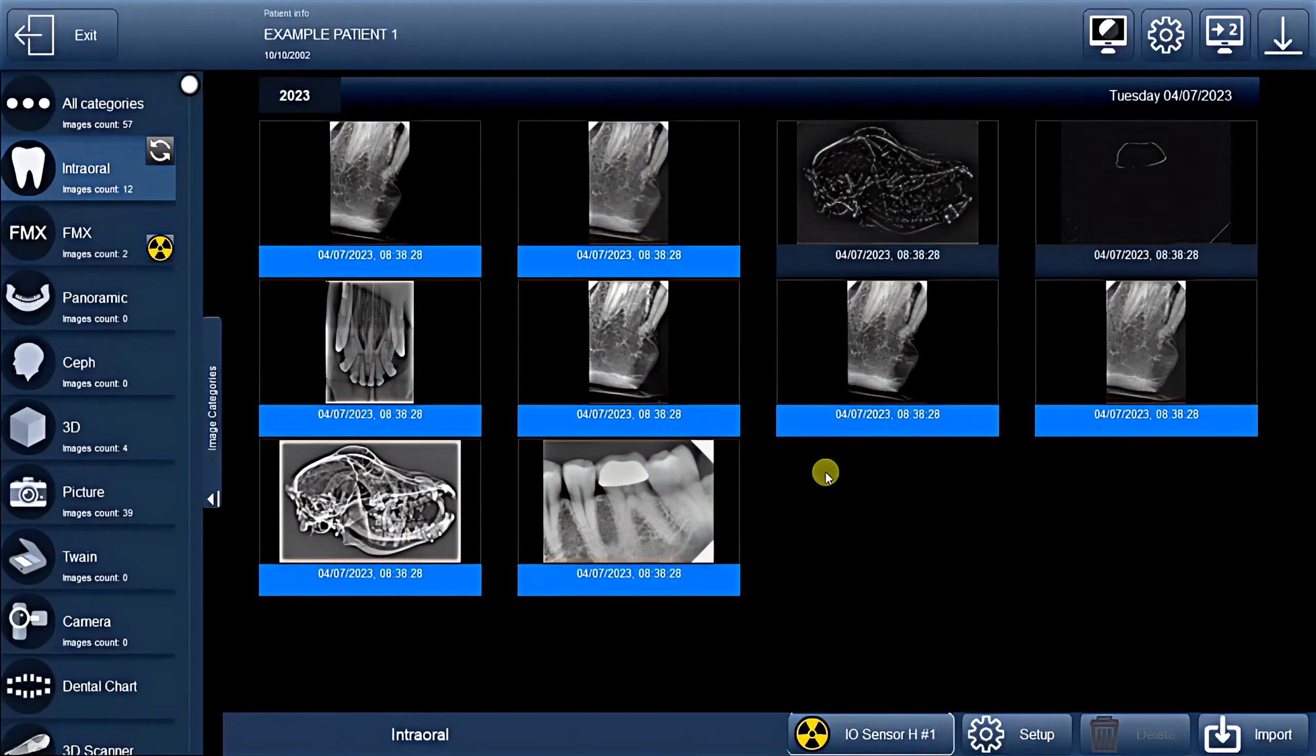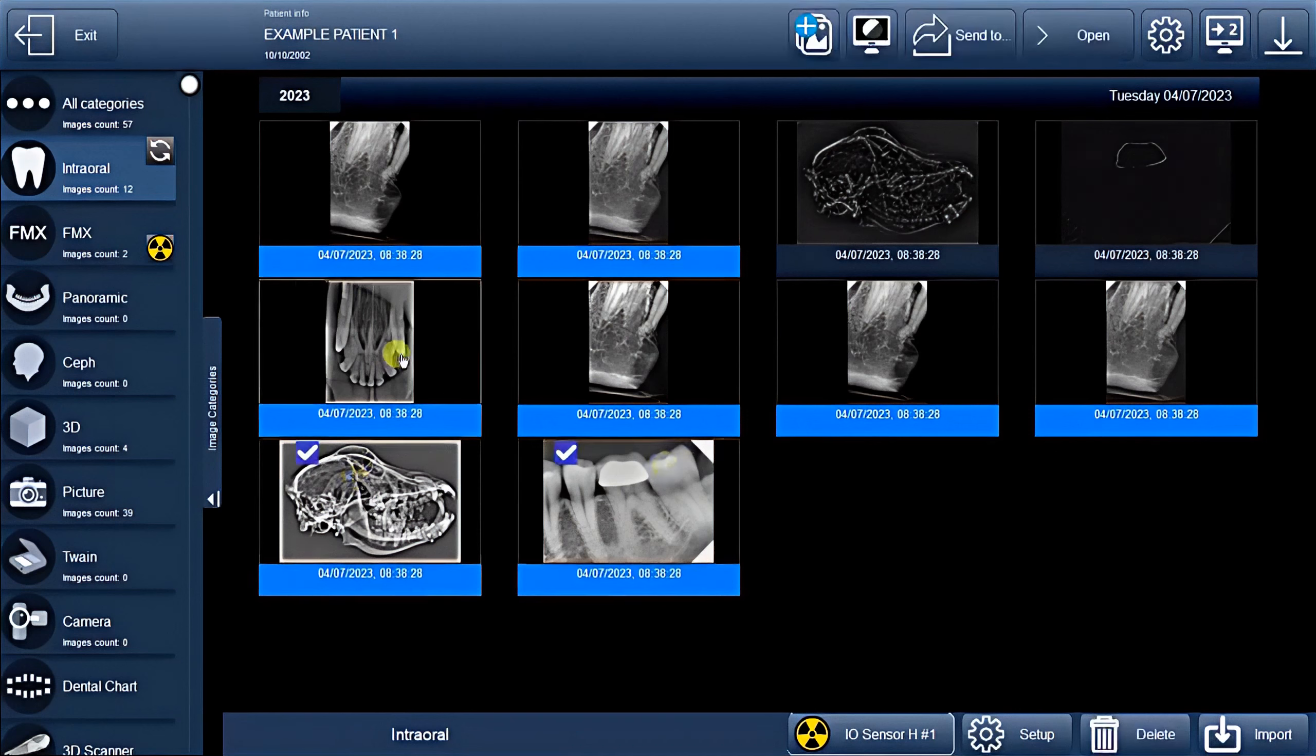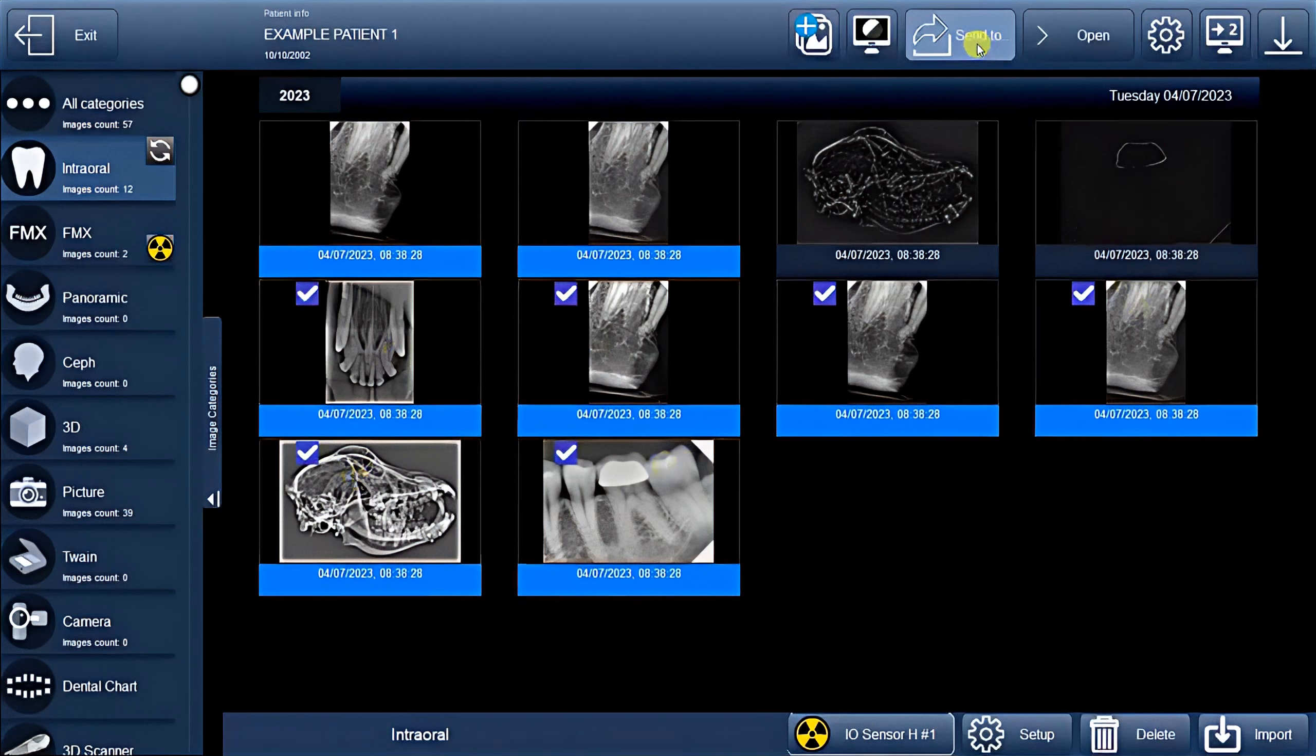Now let's explore the Export function. To begin, select all the images you want to export and then click on the Send To button.